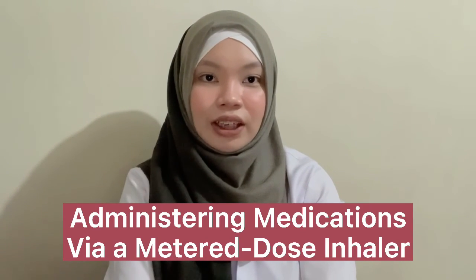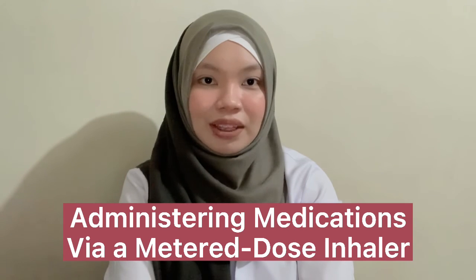This video shows administering medications via a metered dose inhaler, or MDI. It is a handheld inhaler that uses an aerosol spray or mist to deliver a controlled dose of medication with each compression of the canister. The medication is then absorbed rapidly through the lung tissue, resulting in local and systemic effects.